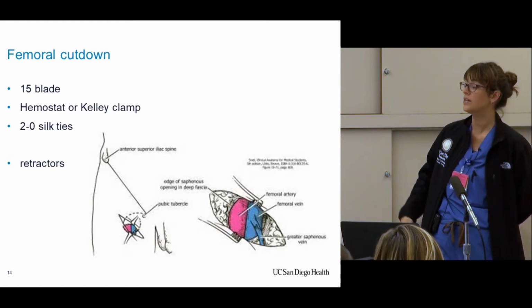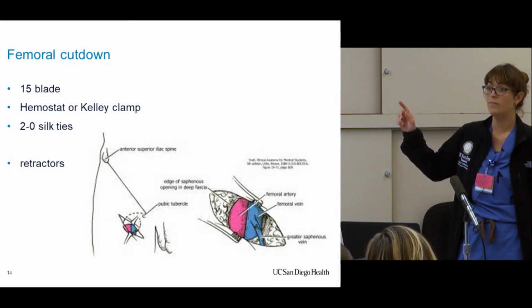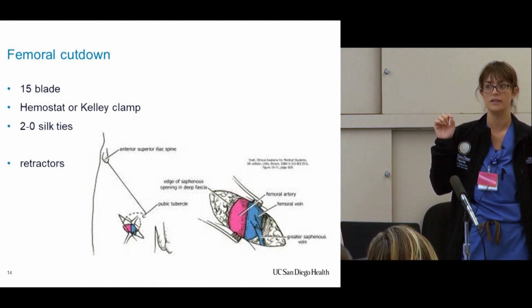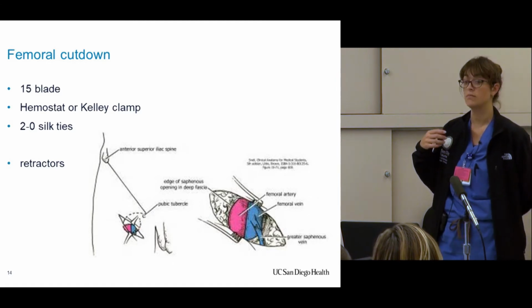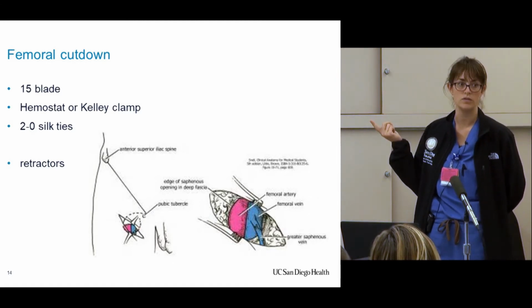However, if someone has really crappy arteries, really heavily calcified, we may run into trouble getting that REBOA in. In fact, dilating vessels that are really atherosclerotic and calcified can be extremely challenging, and sometimes we need to get a better grip. And this is how we do that.